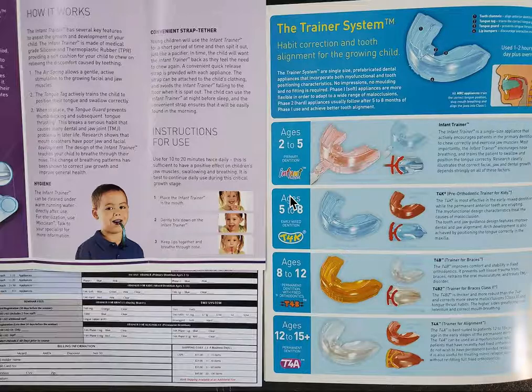So if you're interested, you're welcome to contact me and get a copy of it, info@straightsmilesolutions.com. I just have to verify that you are a licensed dentist before I give it to you. But yeah, I can see a point for the infant trainer for sure. It does help a little bit with tooth alignment as well, tongue position, has a tongue guard and a lip bumper.